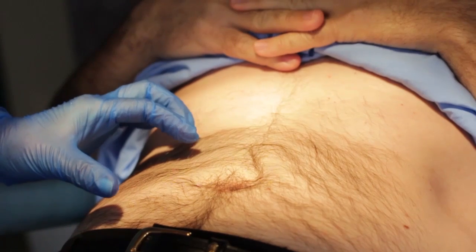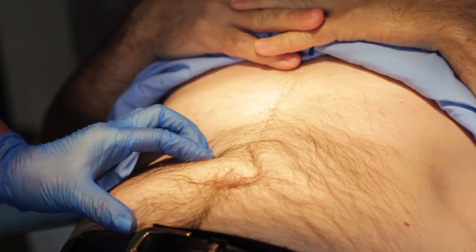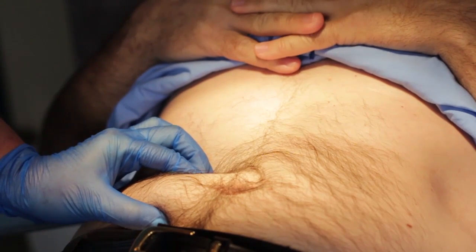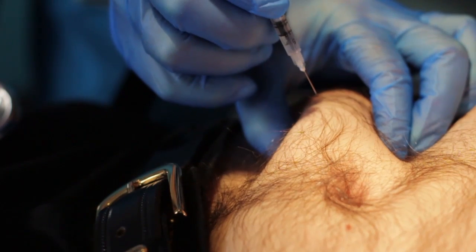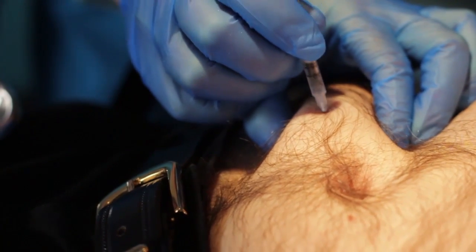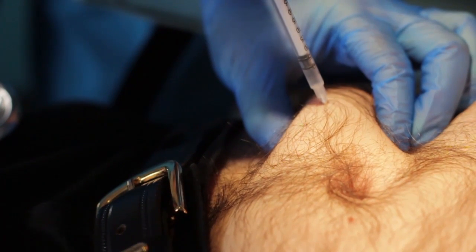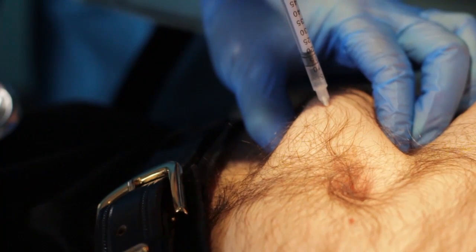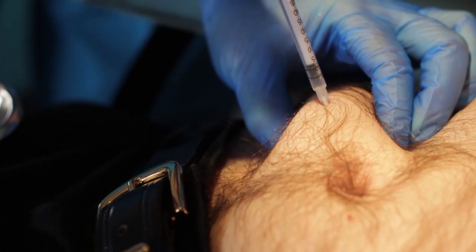Open the index finger and thumb of the non-dominant hand about 2 inches apart and place them on either side of the planned injection spot and pinch the skin. While continuing this hold, insert the needle into the skin in the center of the skin fold so that the needle is at an angle of 45 or 90 degrees. Count slowly from 1 to 10 while injecting the medication.